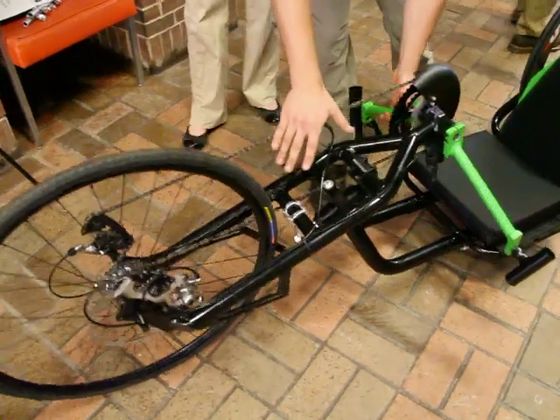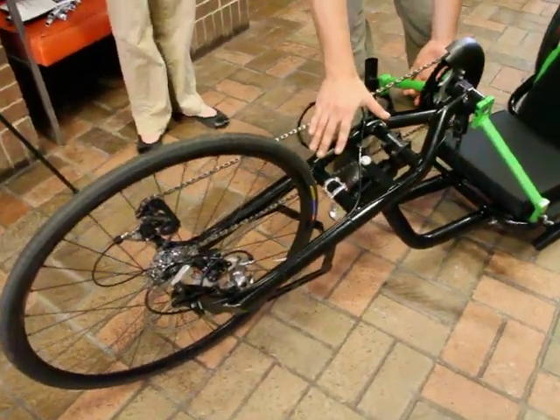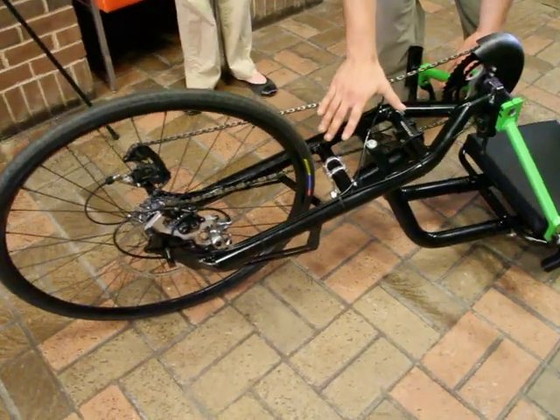Our fork interface is completely innovative and new. It involves two stems — to remove the fork you just take off two stem face plates. The whole fork assembly comes off as one unit.